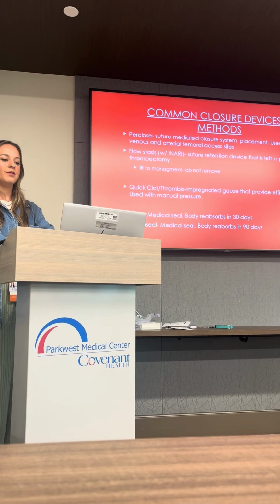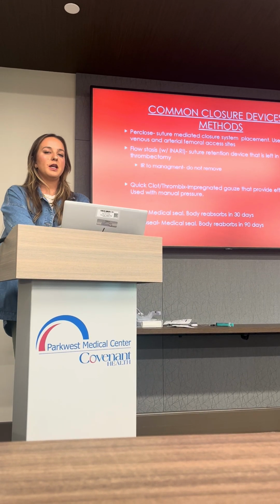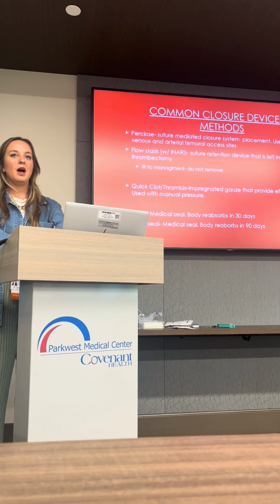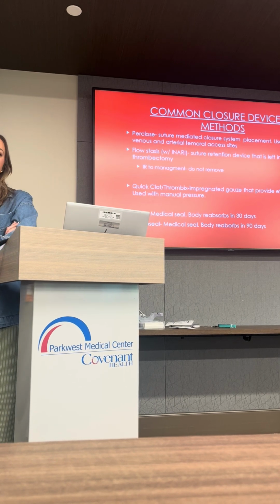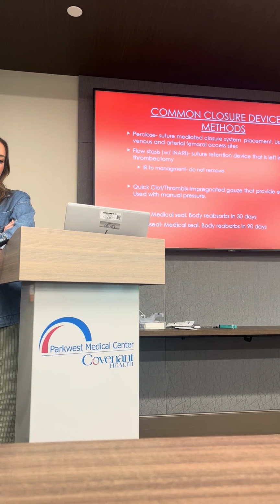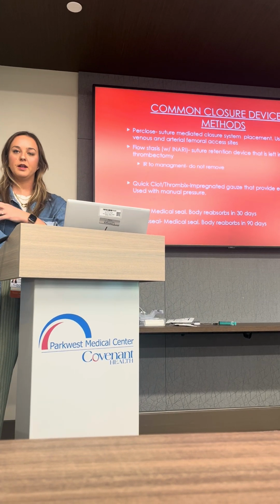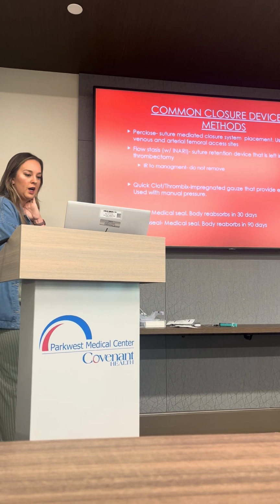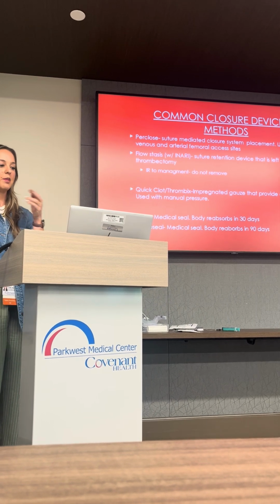Another device that I've not had the experience with as much, but it's something that you all should be aware of, is the Flowstasis used with Inari. So anytime patients have a thrombectomy, oftentimes they'll have this small device in place. It's small and white. I wish I would have added a picture to it. It's typically covered with a bandage or something underneath it on their groin site, but it needs to stay in place, I think 24 hours. A provider comes the following day to remove it. It's not something you touch or move, correct? Okay, cool. So again, just be aware of that. If your patient has that, make sure you're documenting that, make sure you're passing that on.